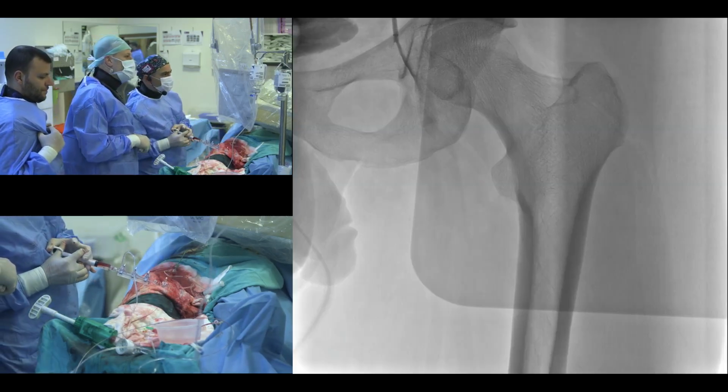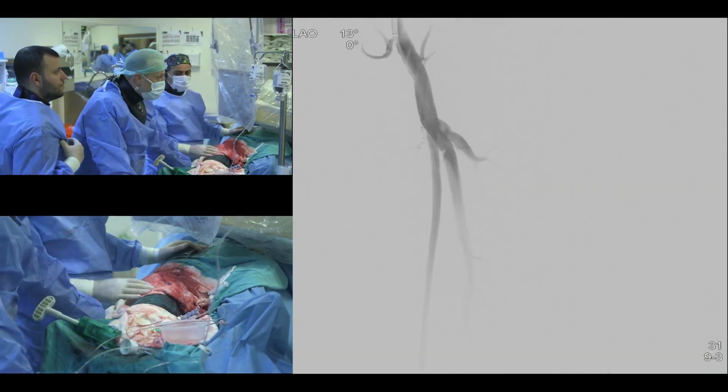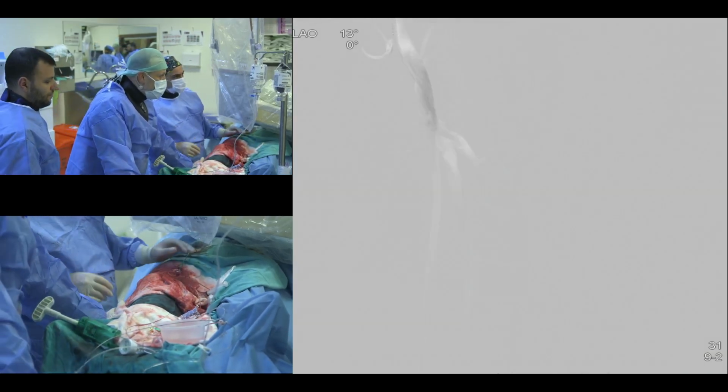Ersan, can you hear us? Yeah. What have you done so far? Can you summarize the case, please? Yes, we have taken the last image now.